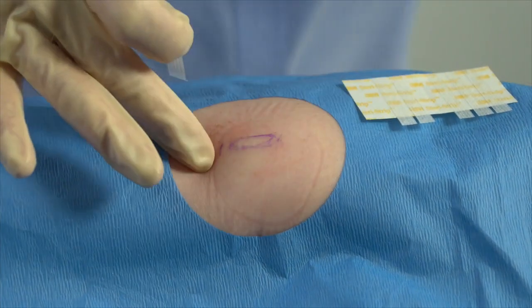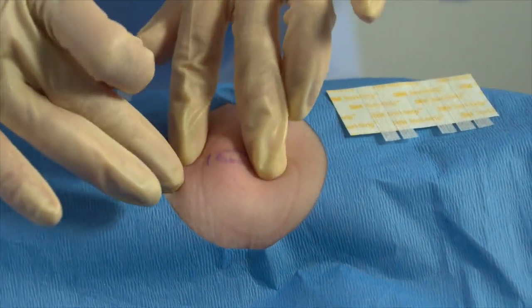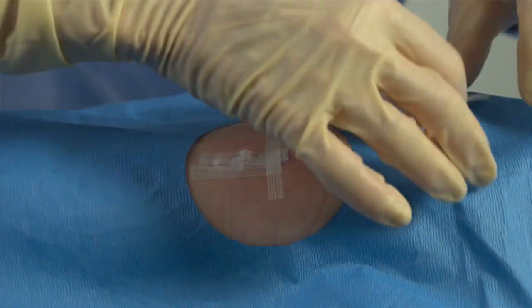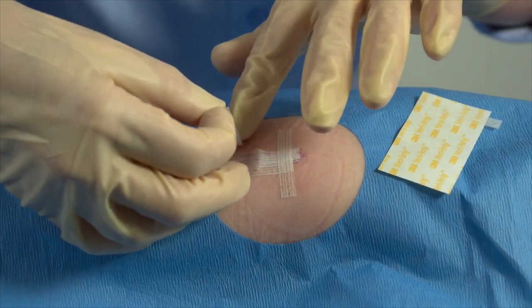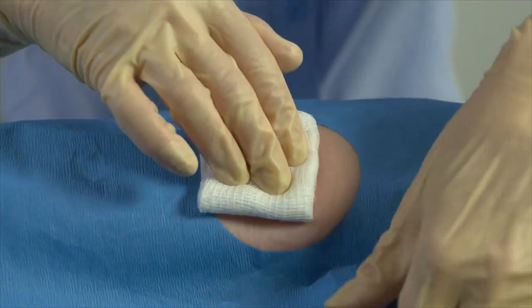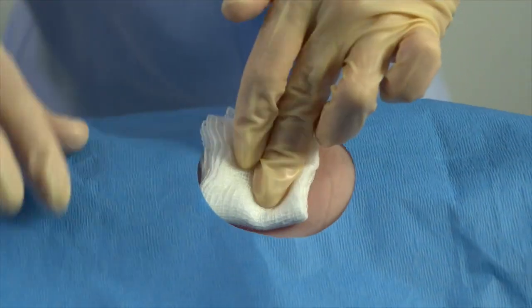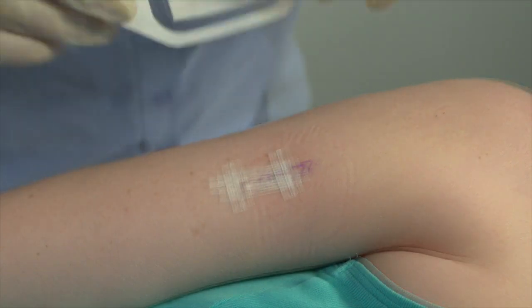Once the incision area is dry, gently align the edges of the incision together and place 3 steri-strips across the incision line. If desired, place 2 additional steri-strips perpendicular to those just placed. The steri-strips should lie flat and not gap to ensure the best healing of the incision. Place sterile gauze over the steri-strips and hold it in place while removing the drape with aperture. Then apply a padded tegaderm over the steri-strips.